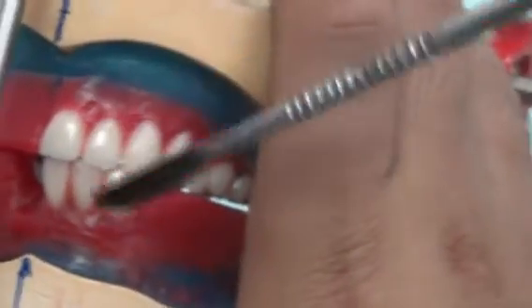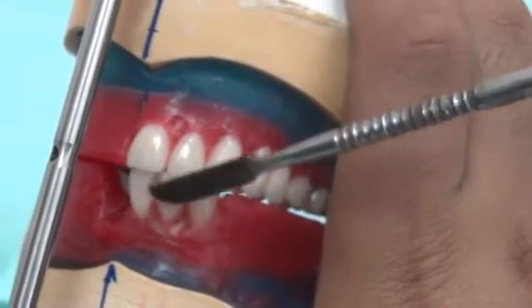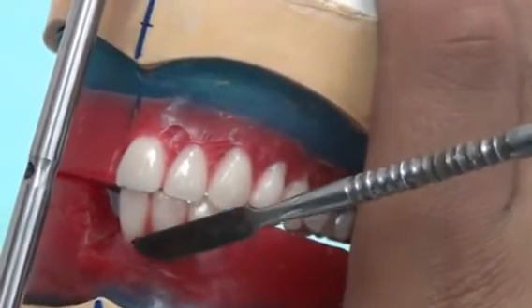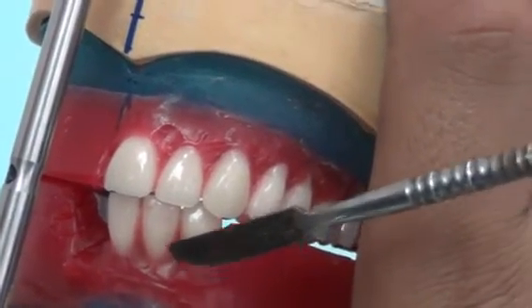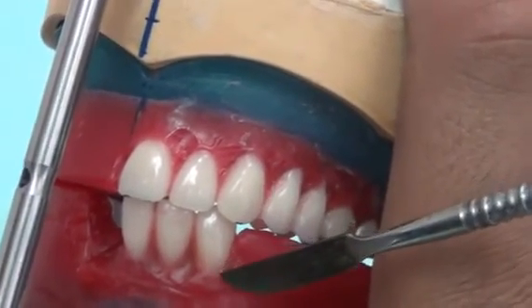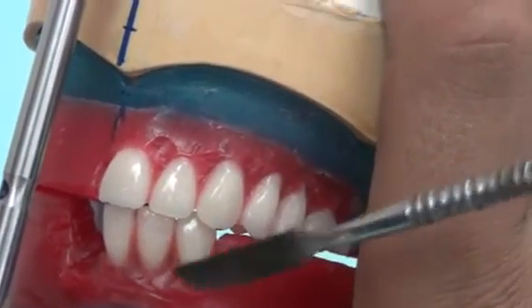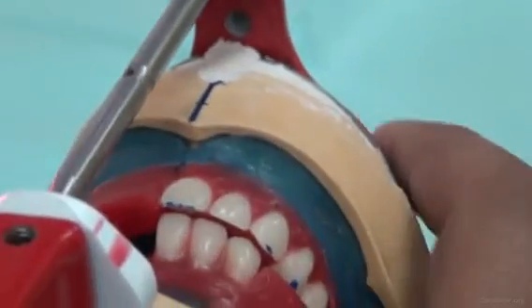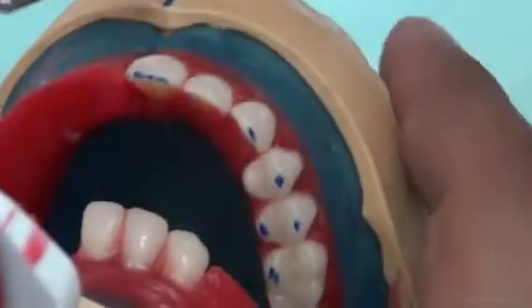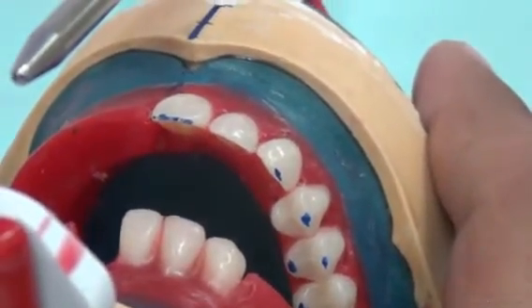We also have the lower central incisor with a slight distal divergence of its root, the lateral incisor a bit more divergent, and the canine more towards the distal. These are the root locations. There is a prominence for the root of the canine, while these are depressed, making the tooth inclined labially. But if we open and see the incisor relationships, these should be straight on one line with the distal of the canine.